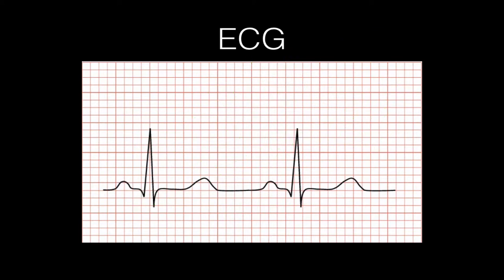Looking at this particular pattern of ECG, it is a normal sinus rhythm in the fact that in each cycle, there's approximately the same amount of squares that it takes up. The ventricles are contracting normally as the height of the QRS complex is the same throughout.